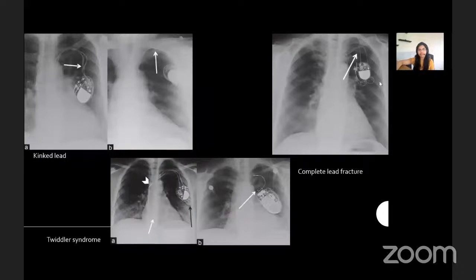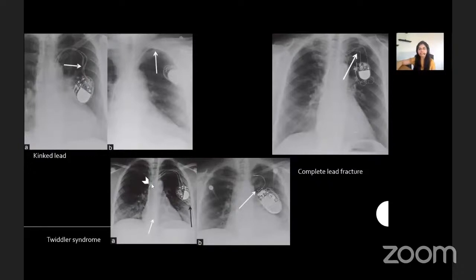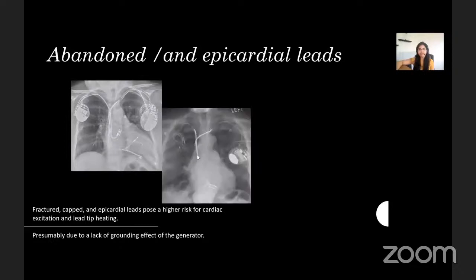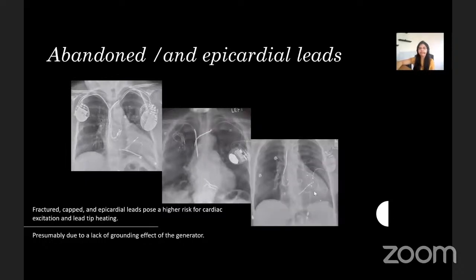Kinks in leads could lead to pacemaker malfunction. Complete lead fractures are seen as discontinuation of the lead wire proximal to the generator; the wide gap represents dislodgement and migration of the lead segments. Twiddler syndrome occurs when the generator is rotated by a patient, causing the lead wires to dislodge and wind around the generator. In this case, the right atrial lead has been removed from the right atrial appendage and lies in the superior vena cava, and the right ventricular lead now lies within the right atrium. Suspect abandoned leads when multiple pacemaker leads are seen in the RA or RV that are not attached to any generator.